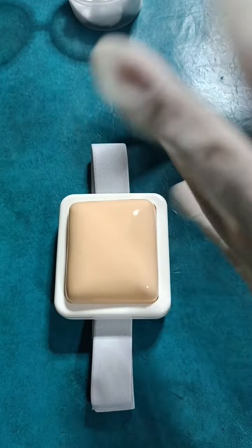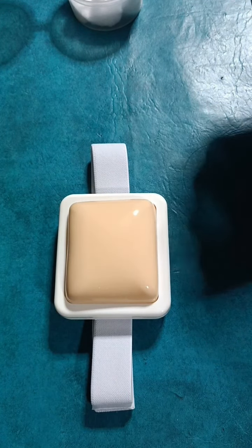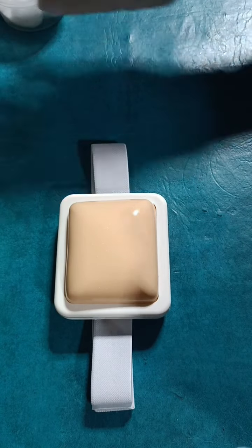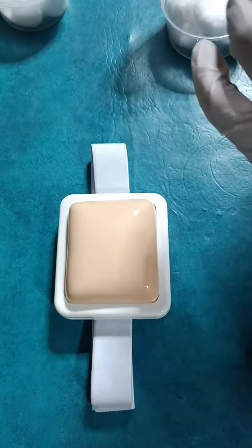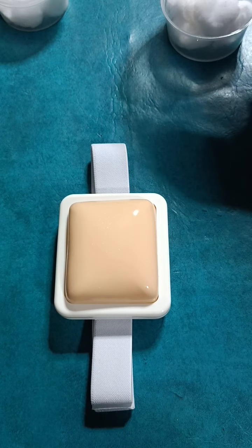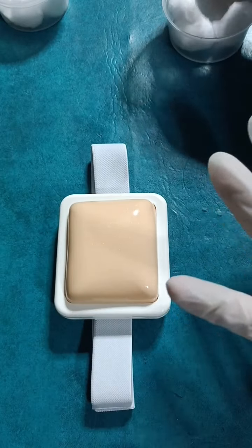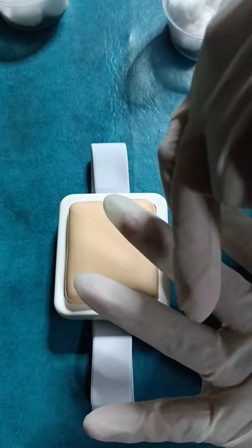Hold the swab between the third to fourth fingers of the non-dominant hand, or position the swab on the client's skin above the intended site. So I will be putting the dry cotton ball into my non-dominant hand. It said that it's in the third to fourth finger, so I put it in the fourth finger.